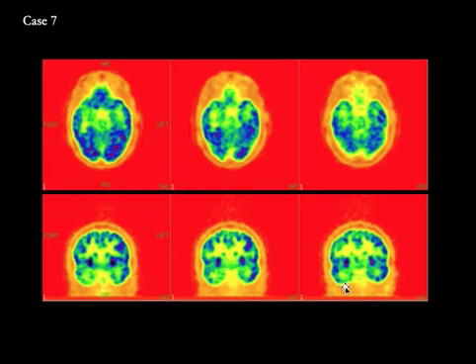And ictal SPECT is performed when they are taken off the seizure medication, admitted to the hospital under EEG and video monitoring, and right at the onset of seizure we inject the tracer, preferably within 30 seconds, and then we wait and acquire a brain SPECT.